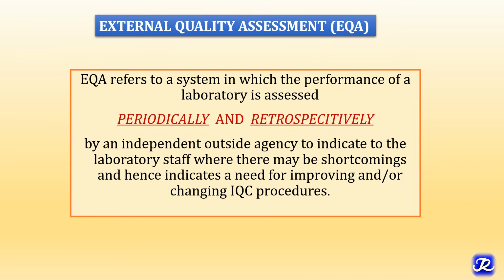External quality assessment, that is EQA, refers to a system in which the performance of a laboratory is assessed periodically and retrospectively. Periodically and retrospectively because we process the external quality control sample in the last week of a month, send the results to the external agency, and then we get a report and get to know the IQC status of our laboratory over that particular month.